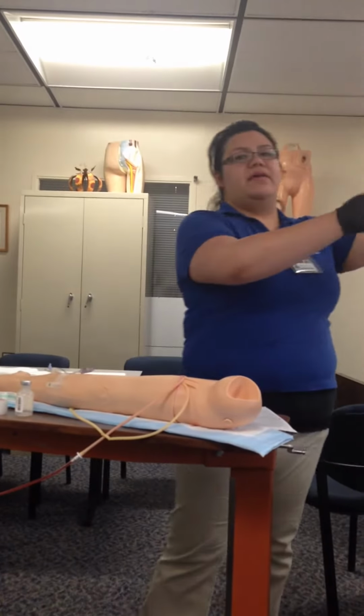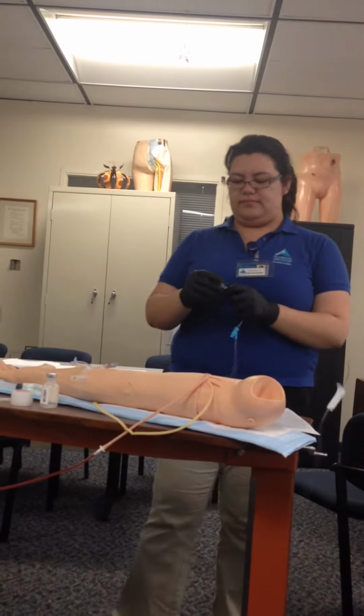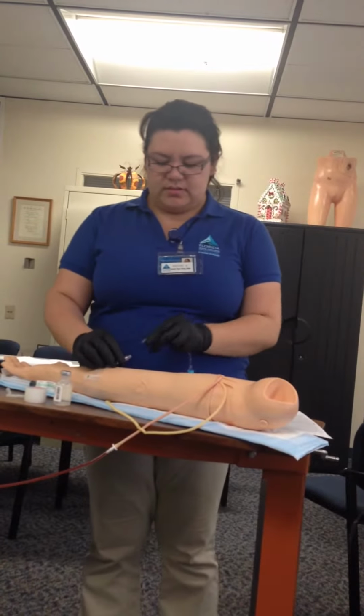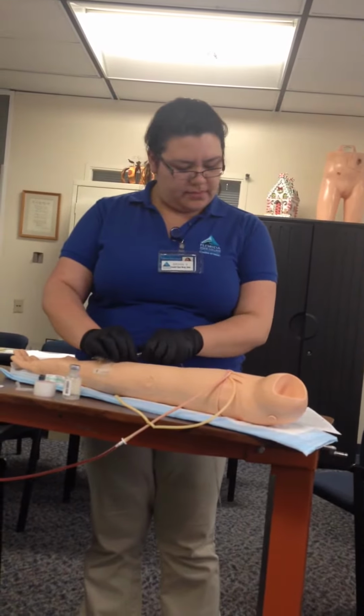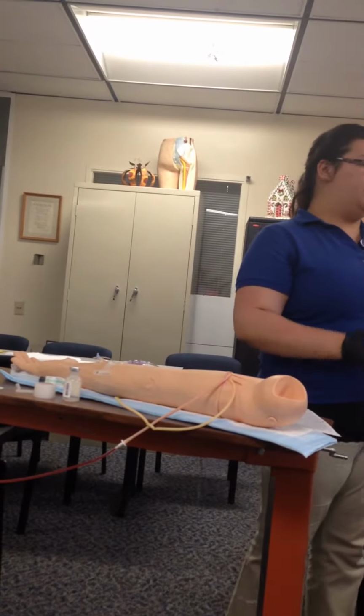So now I'm going to apply the tubing. Alcohol, alcohol. Establish the flow rate. It's going to be 8 drops per minute.